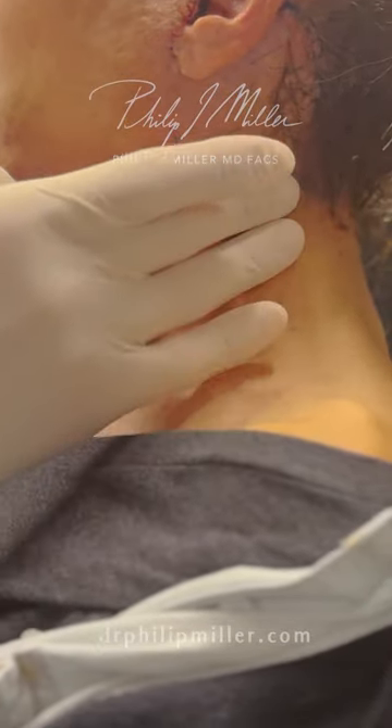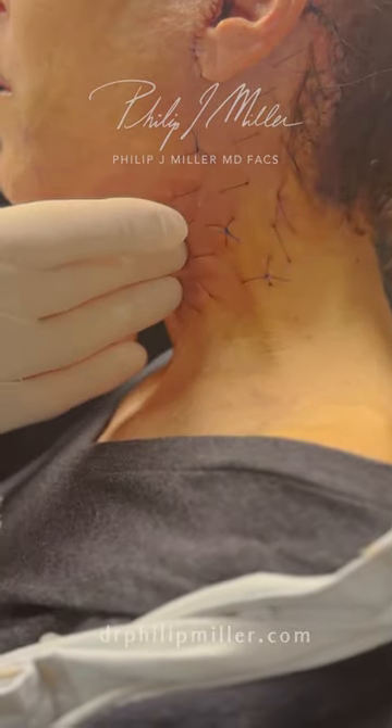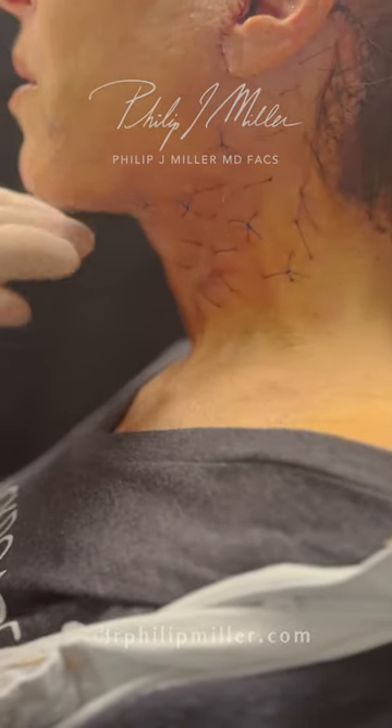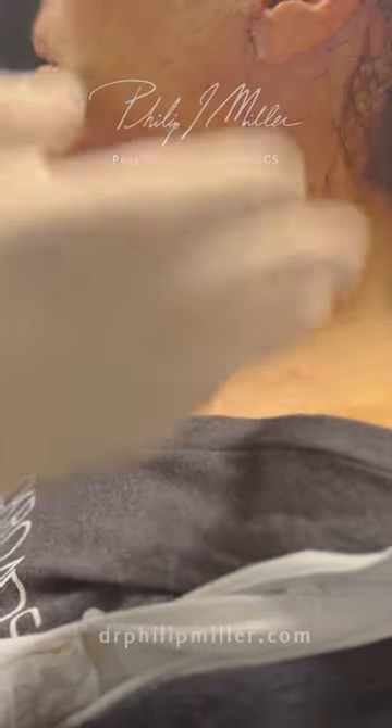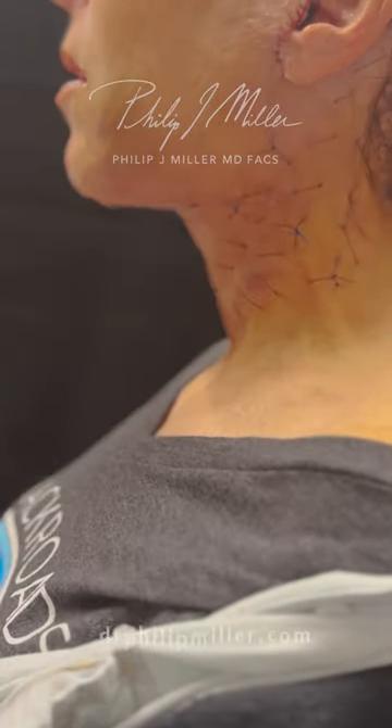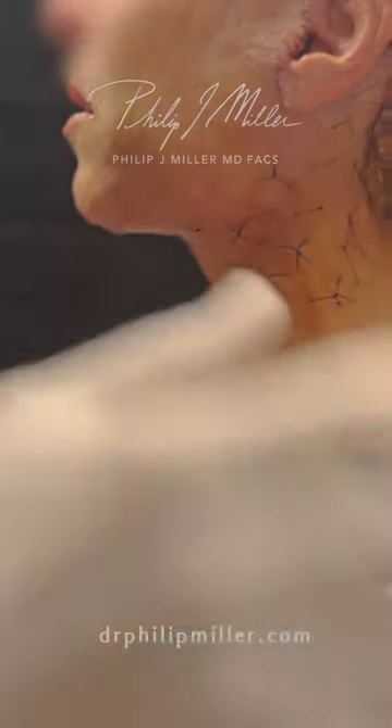And that's to make sure all the skin stays down exactly where I want it to create a really beautiful kind of jawline and neckline here. And then today we're just going to take all those out. We're not taking the incision sutures out, but we'll take all these others out and she'll be able to be on her way just two days post-op.